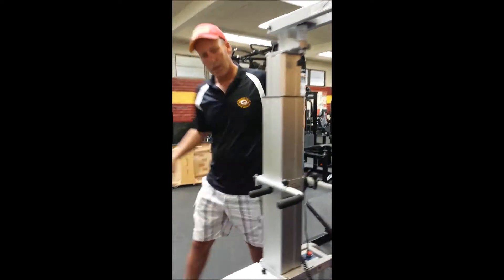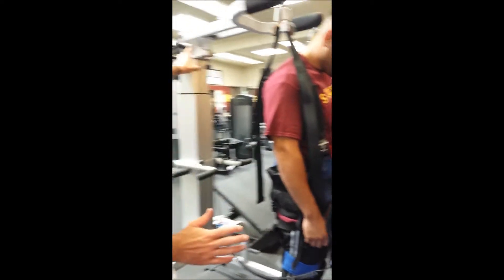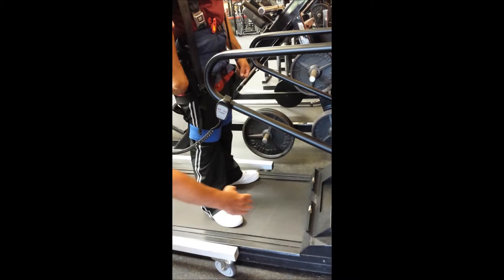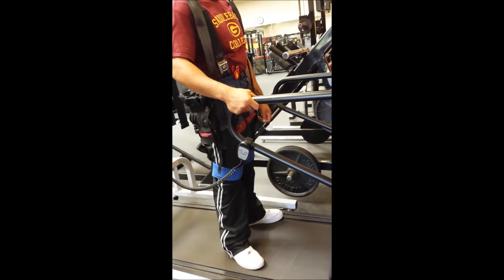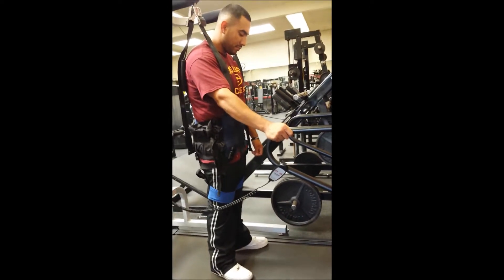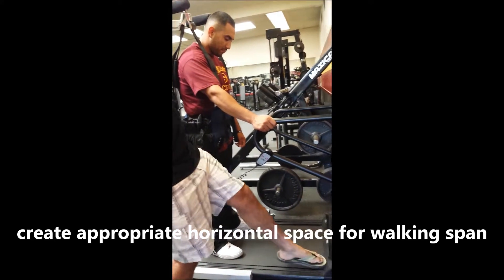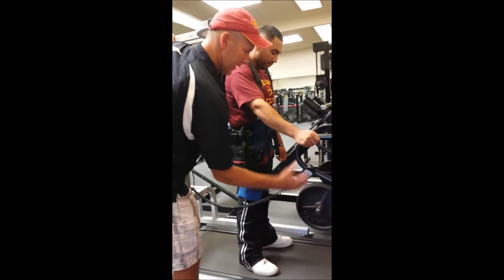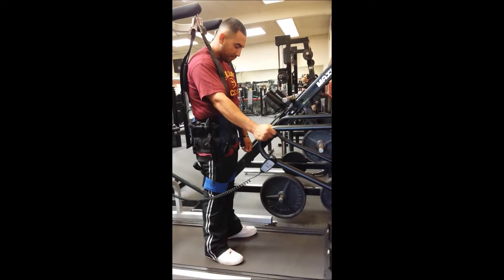He's in a pretty good position now. One key thing is there's not a lot of vertical or horizontal room here, so Tim, I want you to hold on and move back as far as you can. I want to create as much space as possible — if I get someone who's six foot eight, their step length is going to take them close to the end. I try to get them as far back as we can, and then I lock the brakes.